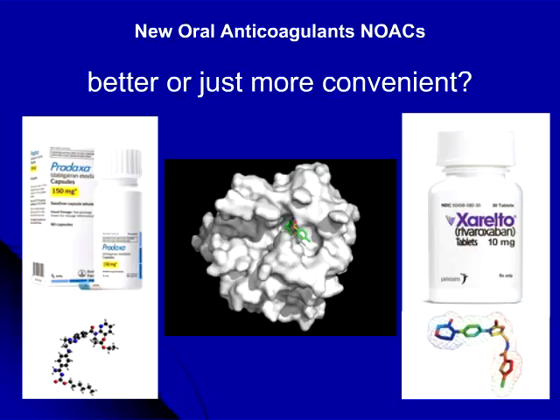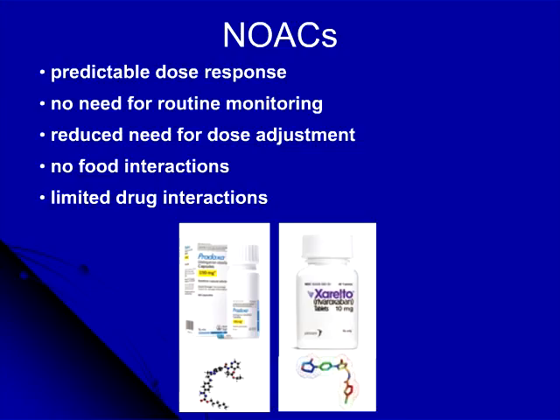Well, how much better are they? Well, I think they're definitely going to be better because they make clinical practice easier. It makes it easier for patients, it makes it easier for clinicians. And of course, for the vast majority of patients, monitoring is not going to be required, so that makes it easier for the laboratory. Having said that, as you will see, when measurement is required, the requirement for laboratory expertise is going to be even greater than it has been in the past.